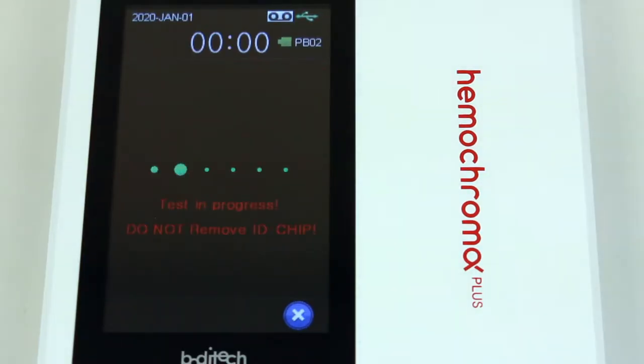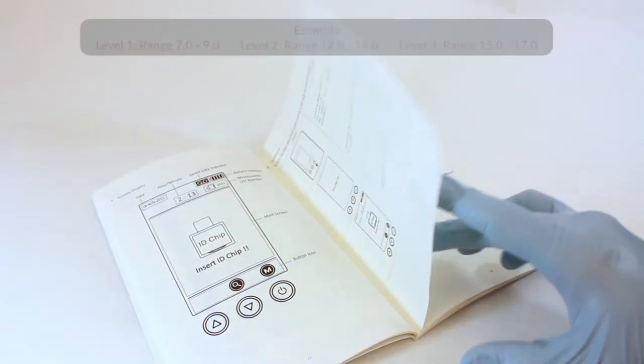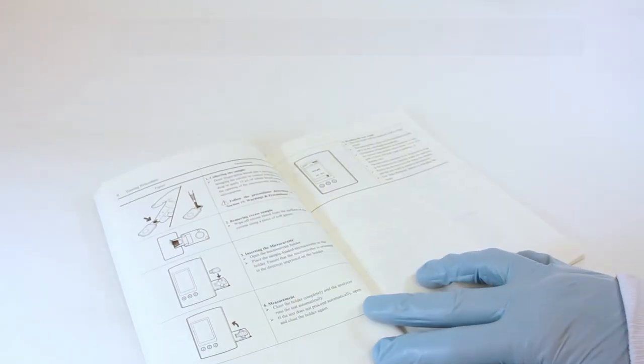The Hemochroma Plus Analyzer calculates the test result automatically and displays hemoglobin concentration in terms of grams per deciliter. Refer to the Materials Supplied and Control Values section for expected control ranges.